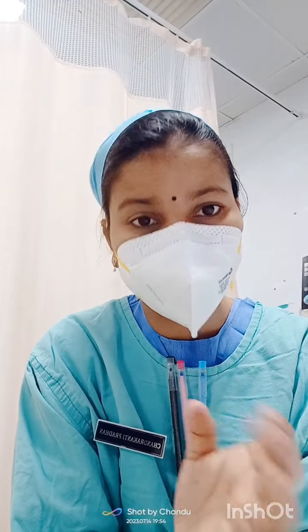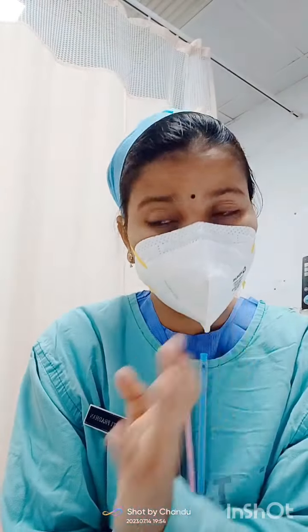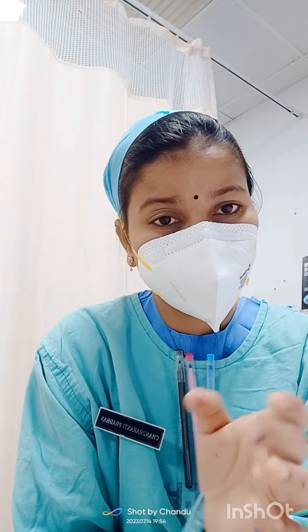The first condition is narrow complex regular tachycardia, for example SVT. The energy requirement is 50 joule. The second condition is narrow complex irregular tachycardia. The examples are atrial flutter, atrial fibrillation, and multifocal tachycardia. The energy requirement is normally 120 to 200 joule in a biphasic defibrillator.